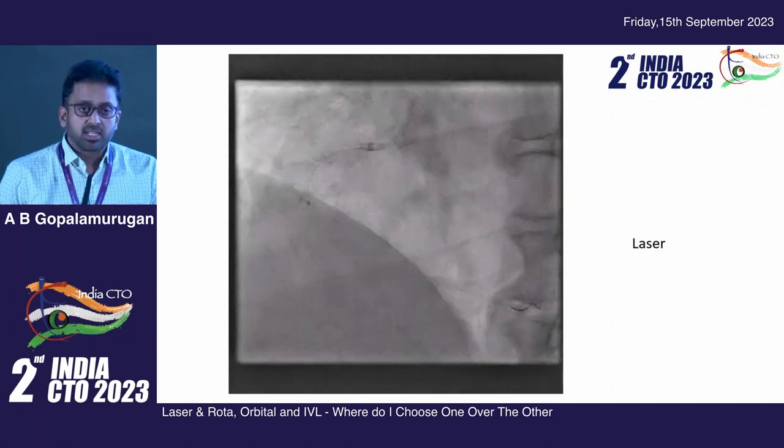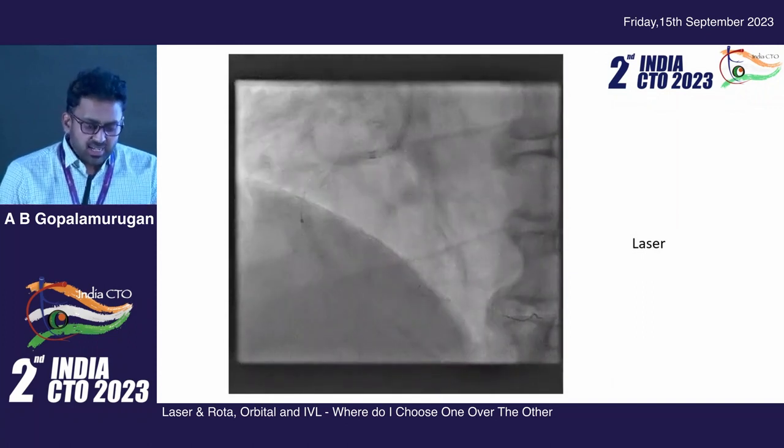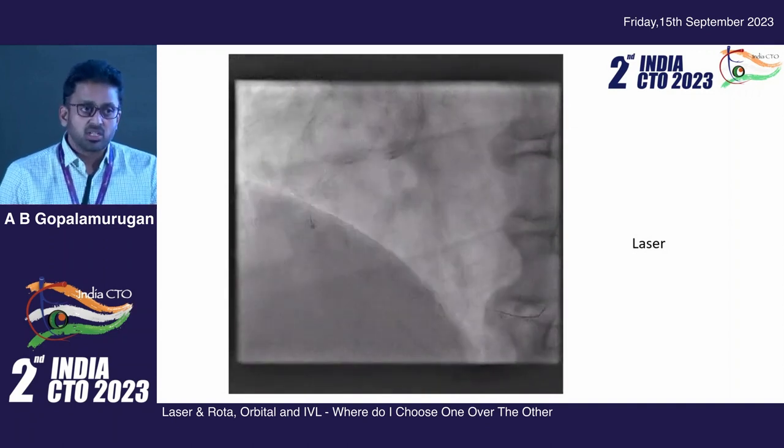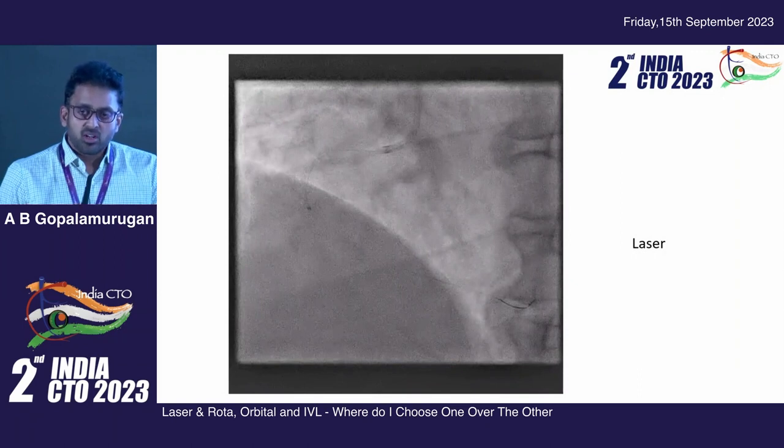This is an ELCA 0.9 catheter, and this is an ideal indication when I would take laser, which is wire through, but no kit will go through, and therefore you cannot do anything other than take a laser. So what would we have done had we not had laser?